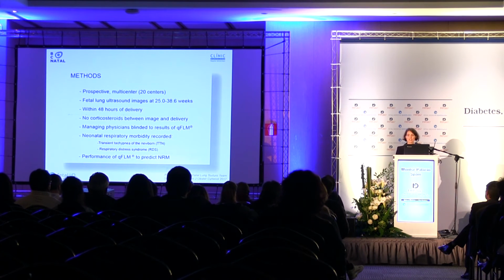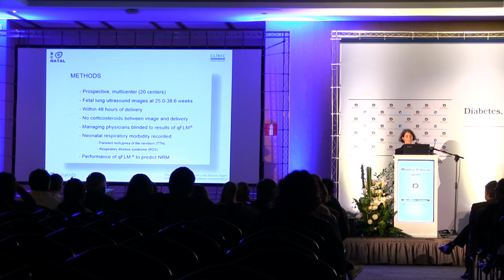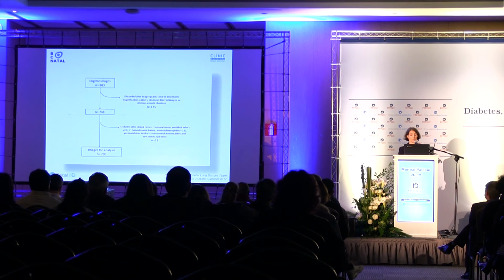Of course, managing physicians were blinded to the results of the test, neonatal obstetricians and neonatologists. And we recorded the neonatal respiratory morbidity in terms of transient tachypnea of the newborn and respiratory distress syndrome. So we test the performance of the tool to predict this morbidity.